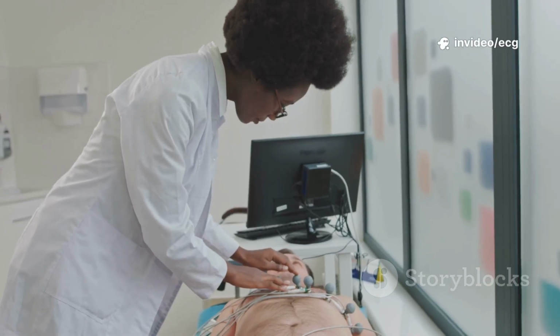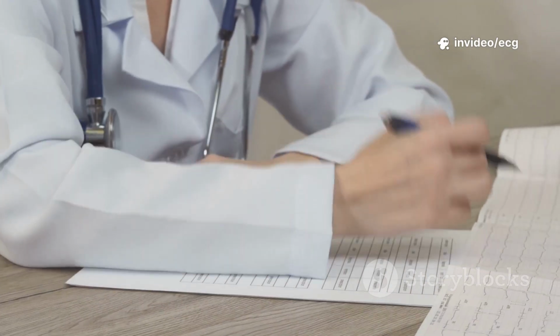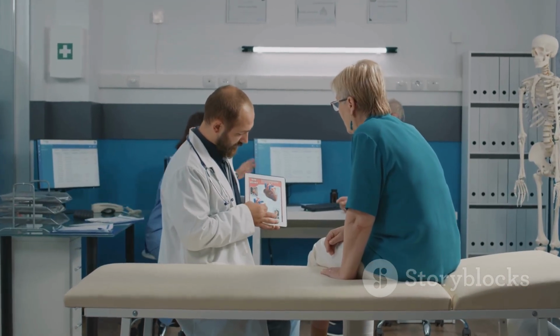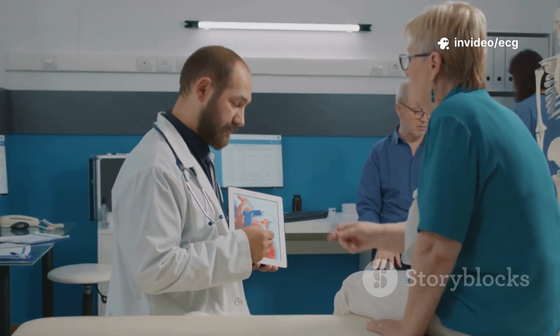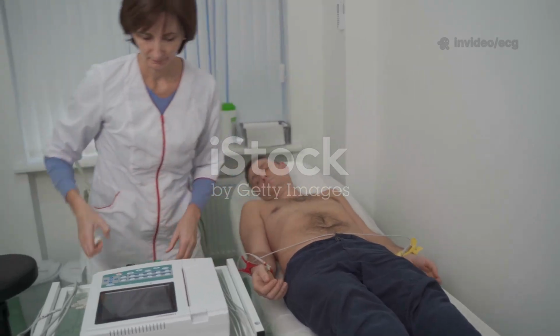Step 2. Determine the rate. For regular rhythms, use the 300 method. Count the large boxes between consecutive R waves. Divide 300 by that number. Example, 4 large boxes, 300 divided by 4 equals 75 beats per minute. For irregular rhythms, count R waves in a 10-second strip. Multiply that count by 6.